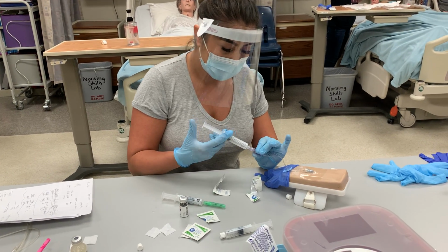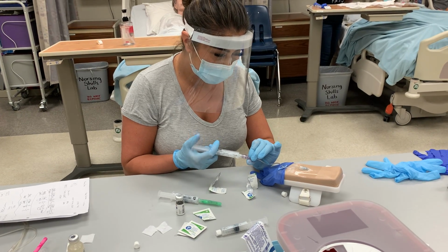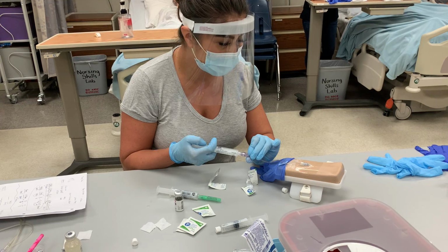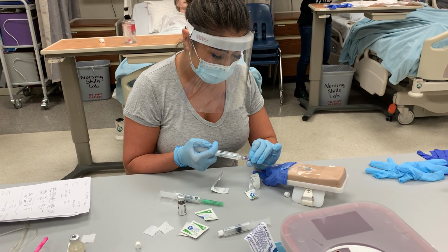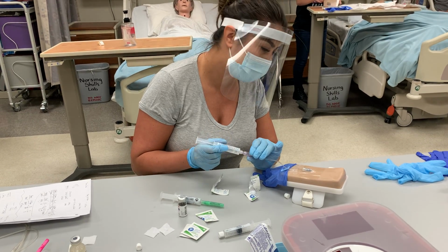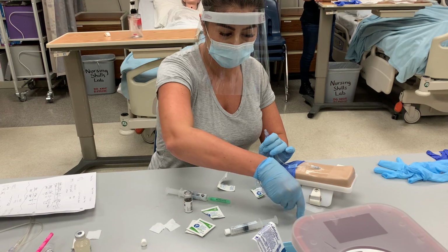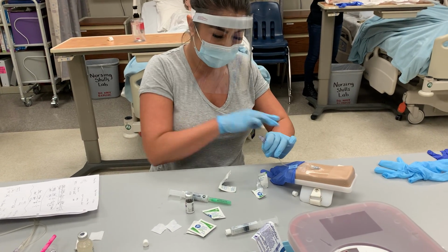I'm going to go ahead and flush the IV with 3 to 5 mLs just to make sure the IV is patent, and I'm going to watch for any infiltration. Okay, that's 3 mLs. It looks good. I don't see any infiltration on there. Now I'm ready to administer my medication.